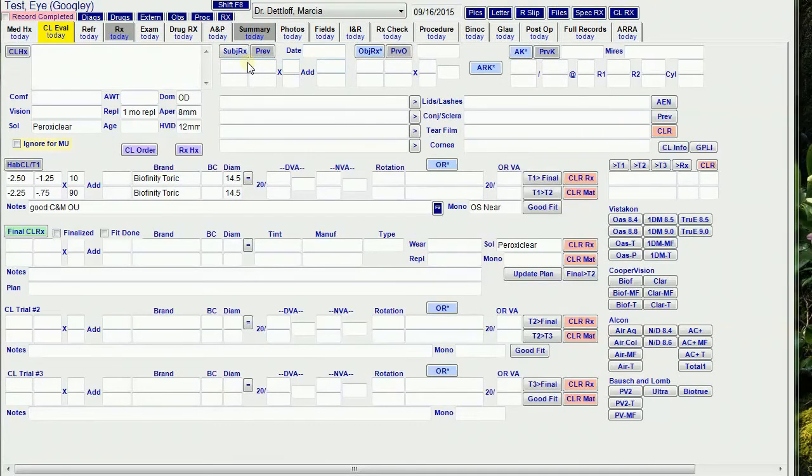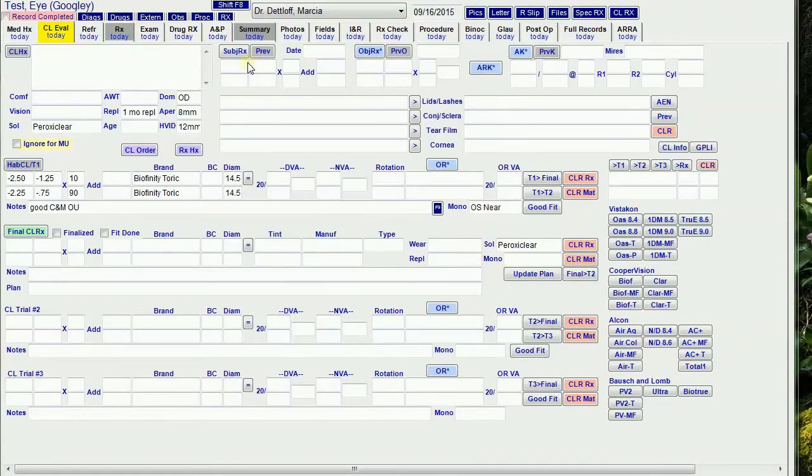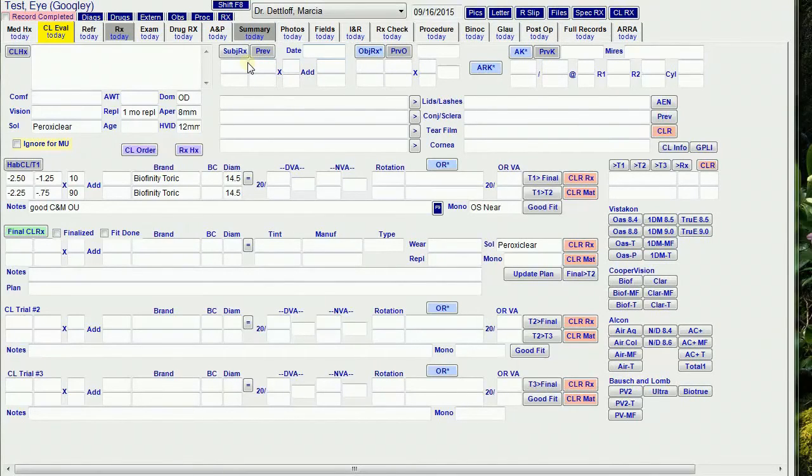But the subjective RX fields are not the same as on the refraction tab, because I wanted to be able to pull forward a previous subjective with the date into these fields at future contact lens visits.